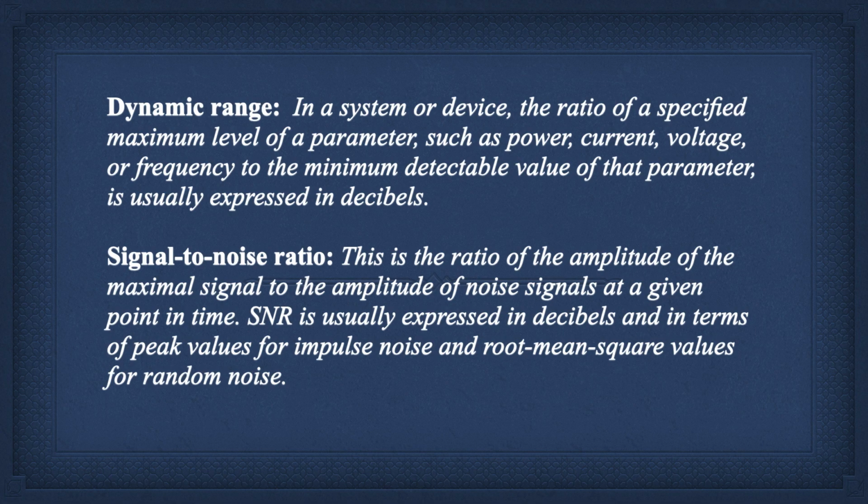And we hope that noise level, and we're predominantly talking about the optical, is near the quantum noise limit, where quantum mechanics sets up a barrier. And again, that's going to be talked about in the quantum mechanics lecture. The dynamic range is what we get on the screen after we digitize it. It's what we see in it.